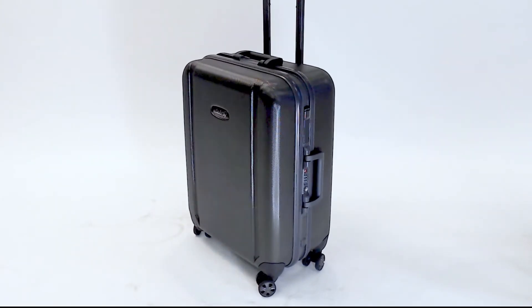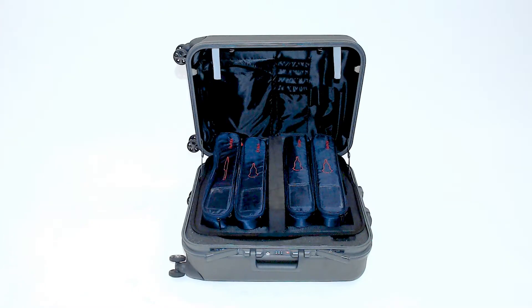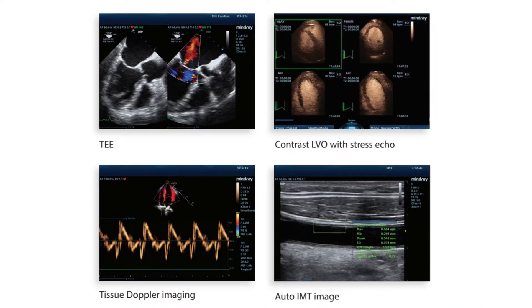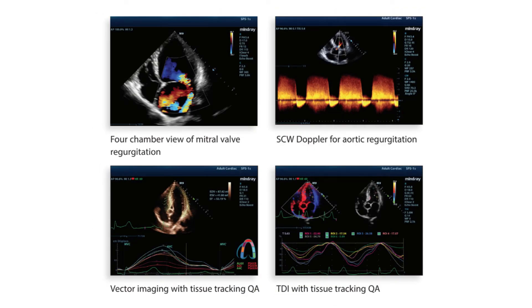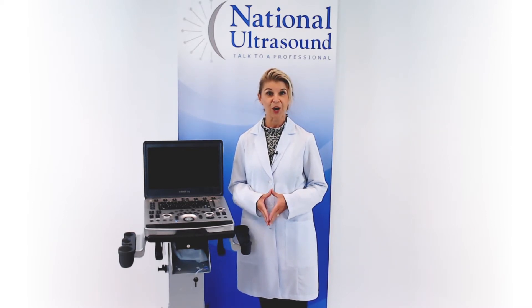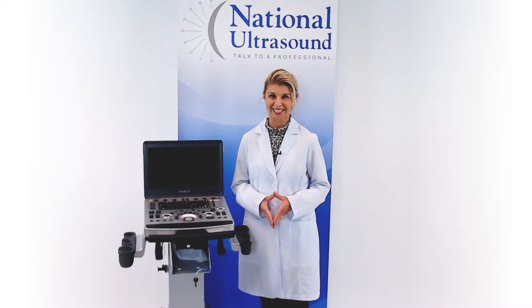The M9 includes a convenient rolling traveling case that can hold up to 4 probes. With its full suite of transducers, the M9 is a powerful and versatile machine for all applications. I hope this Mindray M9 ultrasound review has helped you when comparing ultrasound machines for your diagnostic needs.